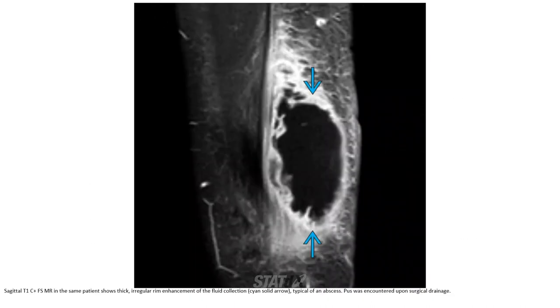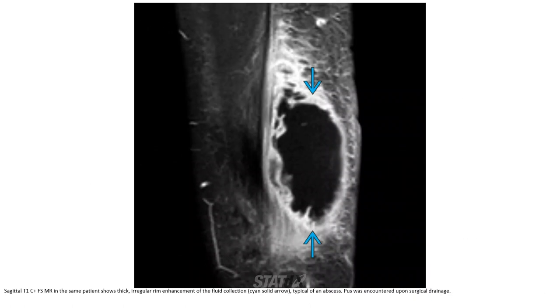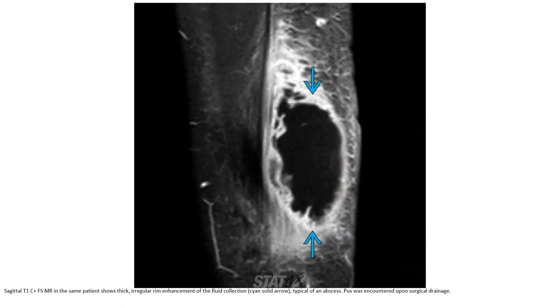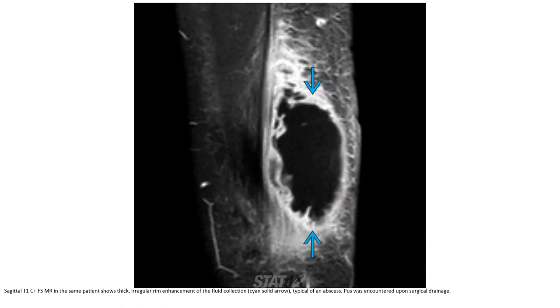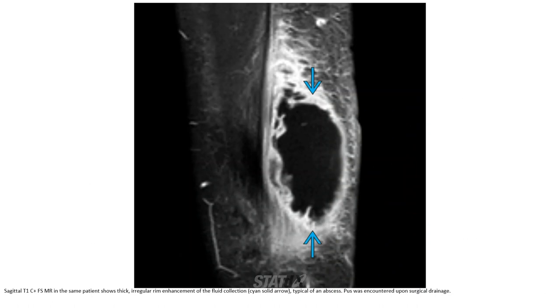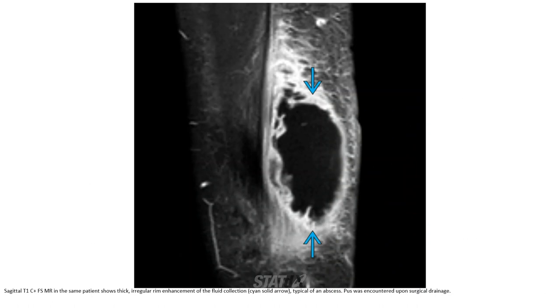This is a T1 post-contrast MRI in the same patient, showing irregular rim enhancement of the fluid collection, typical of an abscess. This was confirmed upon surgical drainage.